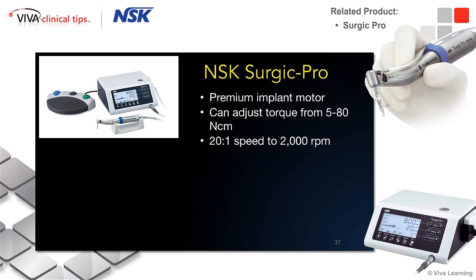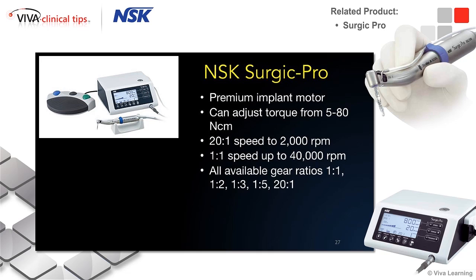You can bring the 20-to-1 speed up to at least 2000 RPMs, though usually we're not going to want to go that high for implant drilling. I tend to stay around 1000 to 1200. The 1-to-1 speed can go up to 40,000 RPM, and that's used for a variety of bone grafting applications, and then it has all these gear ratios that help us.